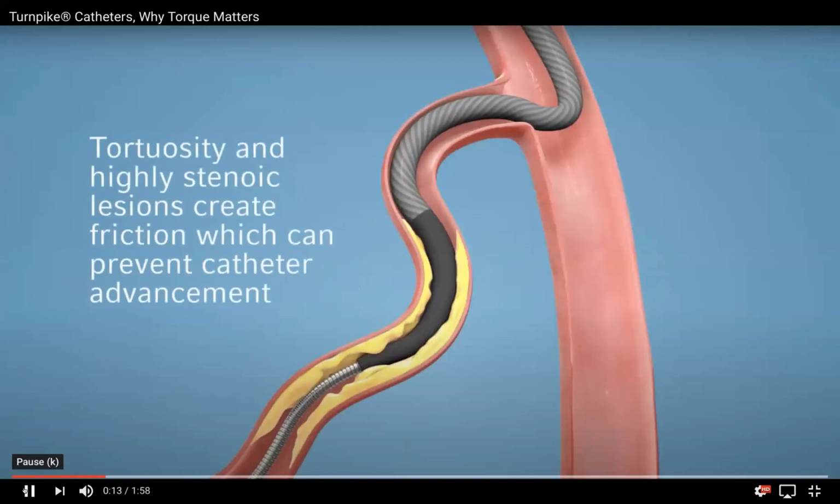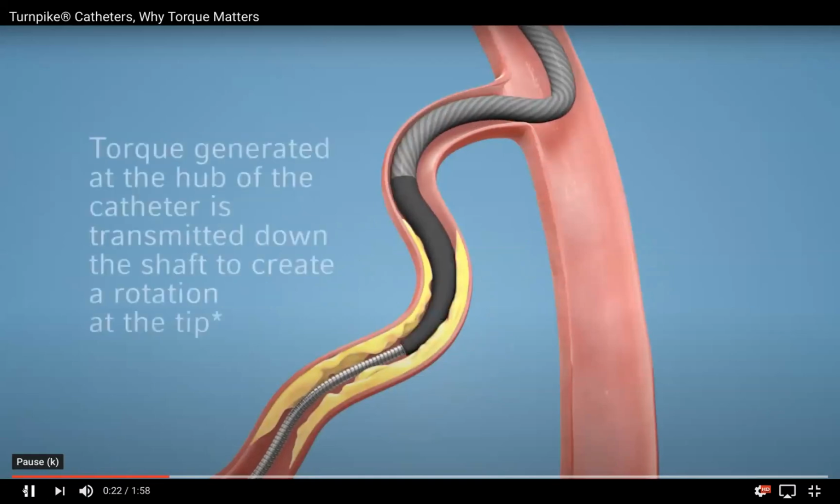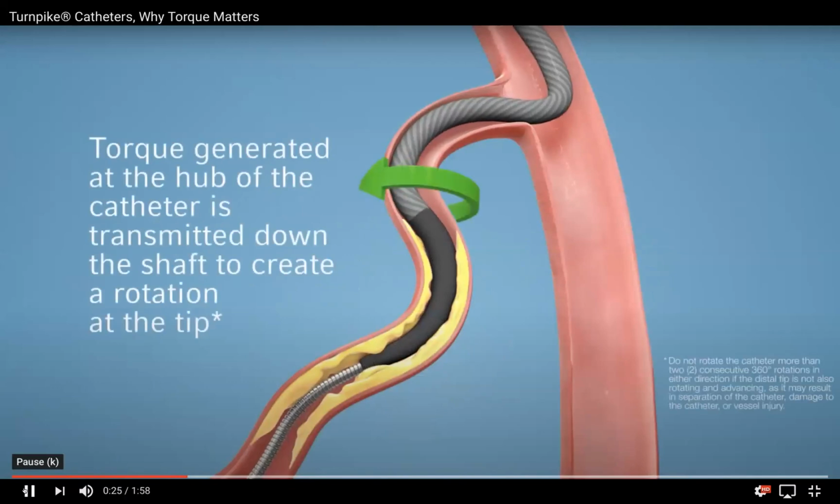They come in various types: Turnpike Spiral, Turnpike Gold, and Turnpike LP, the third one. One question again: balloon angioplasty, bursting it at the mouth of the lesion with an NC balloon. Asif Khan is asking, would that be an option at any stage?